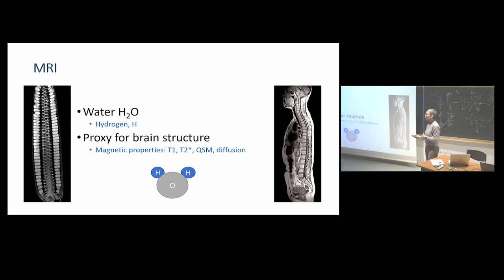So what are we really looking at when we do MRI? Mainly we look at water. We also look a little bit at lipids, and we can use spectroscopy to see some other elements as well, but usually when we sit at the MRI scanner and do diagnostic work, we only use water.